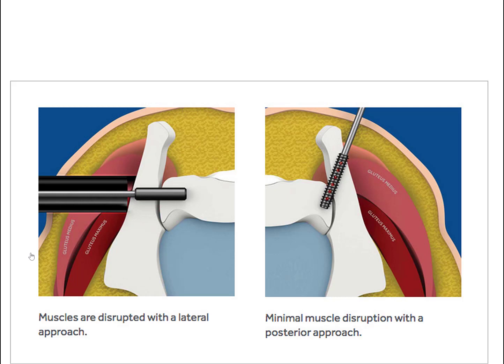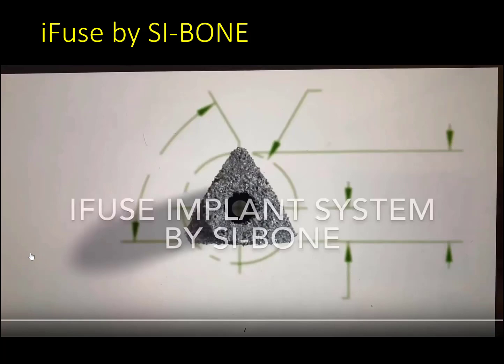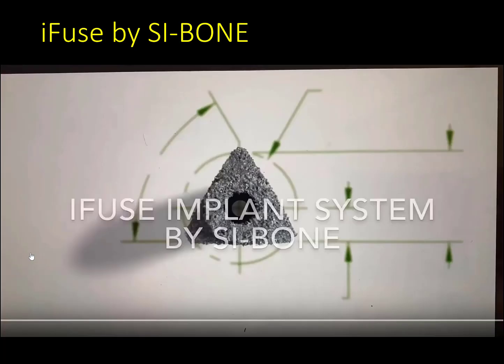My personal opinion is that it's not as good fixation, and people don't have muscular pain from their gluteus percutaneous incisions. What do you think of that, Bobby? I agree. But this is what the company espouses, and this is on the website. Is a perfectly placed SI joint implant from the oblique view. Was that a fused SI joint right there? Yes, that's their fusion of the SI joint. Whether this is fused or not, I don't know. I'll give you a maybe.